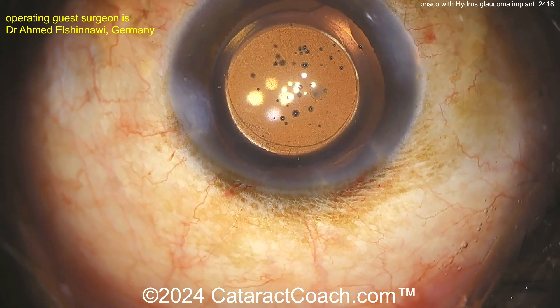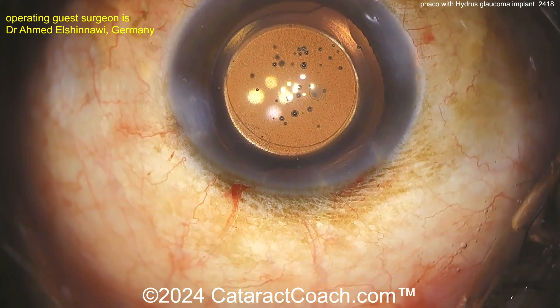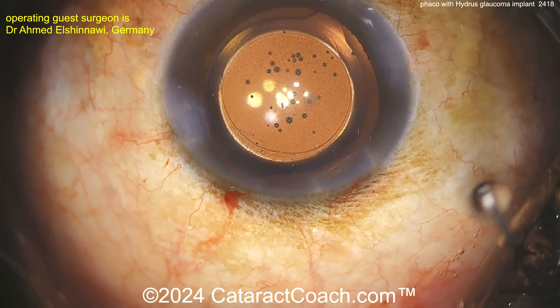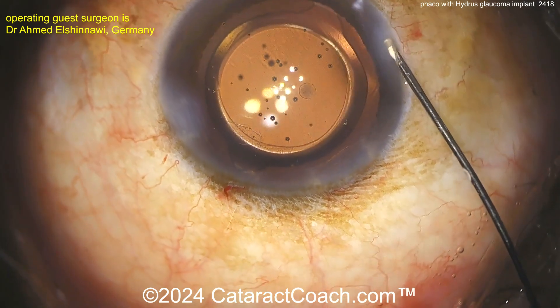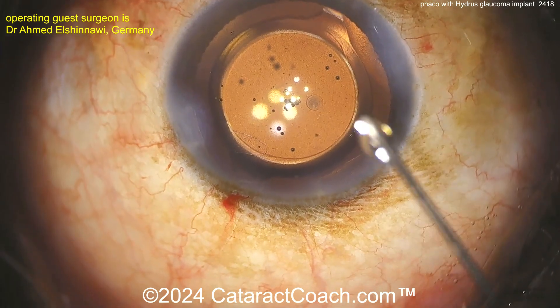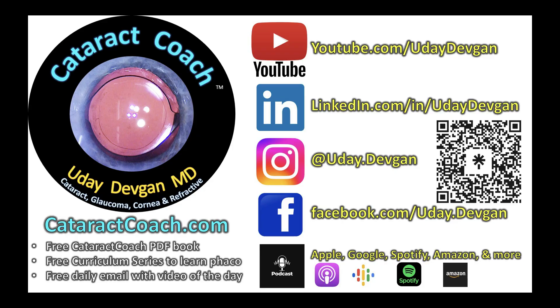I'm not a fan of putting in a trifocal, multifocal, or extended depth-of-focus lens in someone with glaucoma or any other macular disease. You're best served by getting all those photons focused at one focal point — with a monofocal lens. At the end of the case, seal up the two paracenteses and the main incision, flush out any remaining viscoelastic, and the patient will have a beautiful outcome. For more glaucoma content, visit CataractCoach.com — go to the full list of videos and check out the glaucoma category.